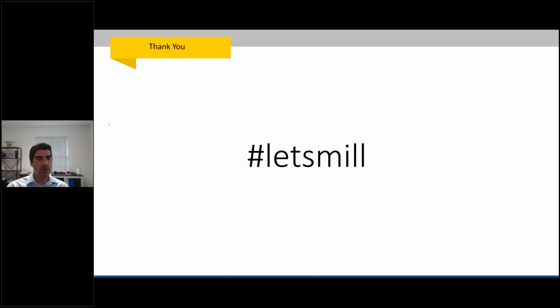It depends on your business type and your business strategy, whether all of those new features are going to benefit you. Some labs certainly are sticking to very basic zirconia crowns and that's it, or maybe crowns and bridges. And some of our new features might pertain to access holes and different restoration types. But generally speaking, we're on pace to do about one new feature every single month. So you can update every single month to just stay on the latest and greatest and ensure, hey, I'm staying up with all my patches and I'm also getting new features. Perfect. Great.